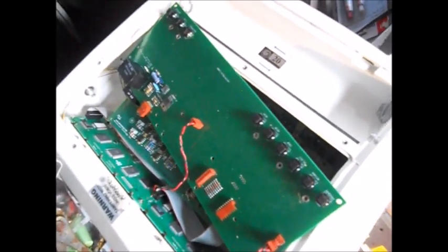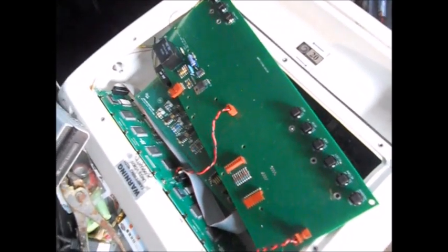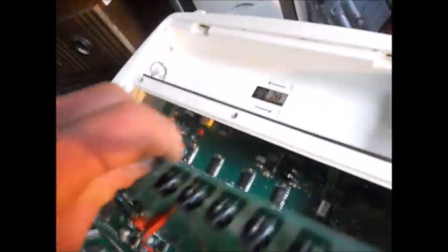And so basically what I have to do is, this has no AC input, so I have to put the DC line into test and trace the DC power on that main board. There's the DC input.